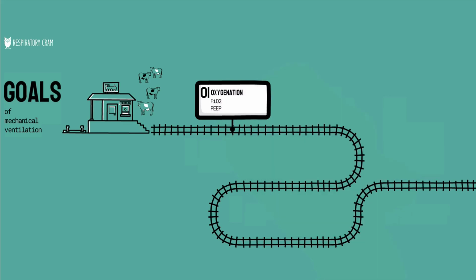And that's essentially the amount of pressure left inside of the lungs when the patient exhales right before they take another breath in. Right at that moment between breaths, there's going to be some pressure left within the lungs, and that's the PEEP. The benefit of that pressure is to keep the lungs or the alveoli from collapsing on themselves. That little bit of pressure splints open the airways, keeps the alveoli nice and pressurized and open, and that obviously facilitates the exchange of gas, including the absorption of oxygen into the bloodstream from the alveoli.